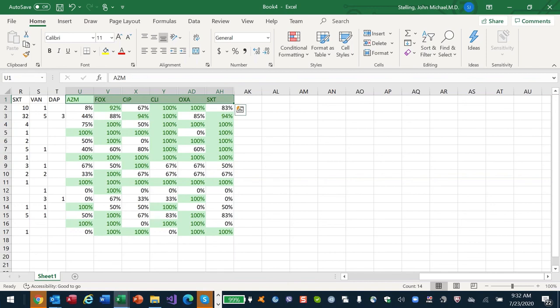What I would like to do is two things. I would like to get the hospital to comply with this list. And this list should be bigger. Erythromycin should be here. And this is the idea of creating a list of minimal testing that you can then score them on. I don't want to score them on daptomycin.